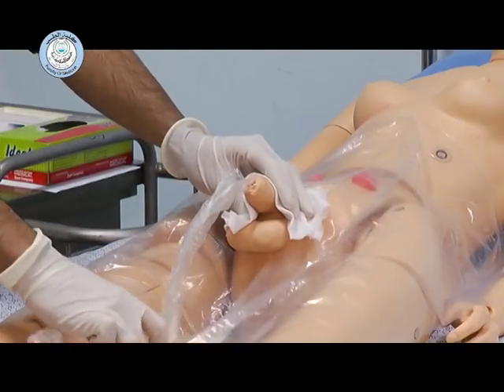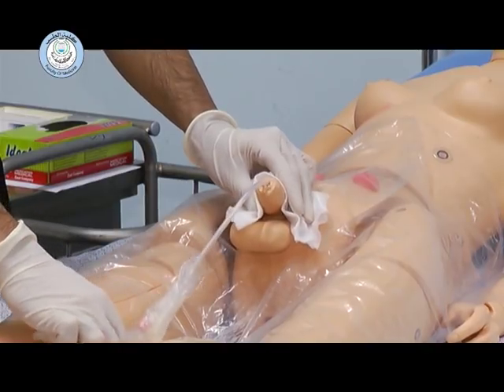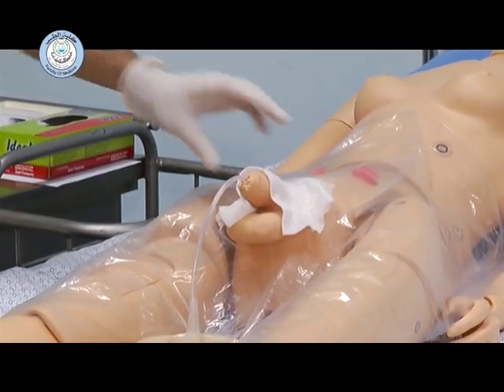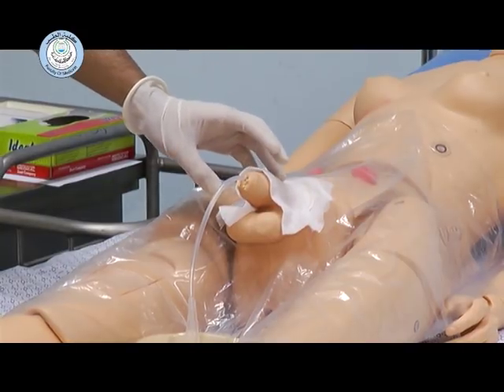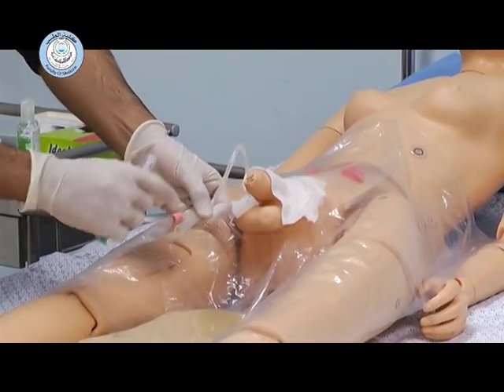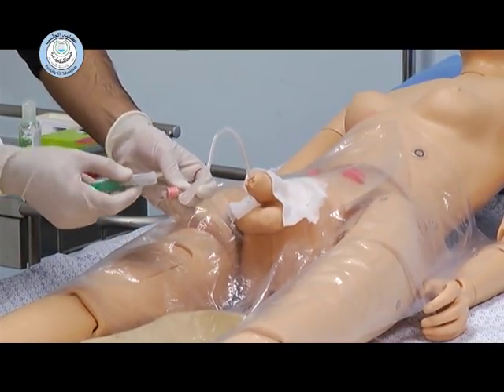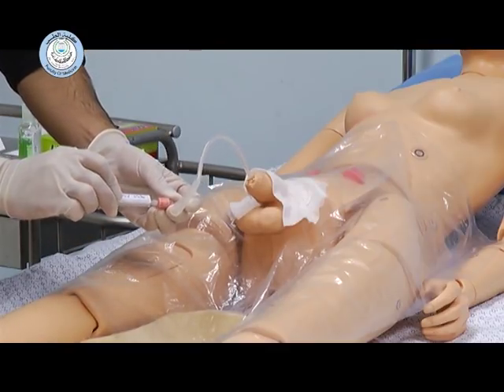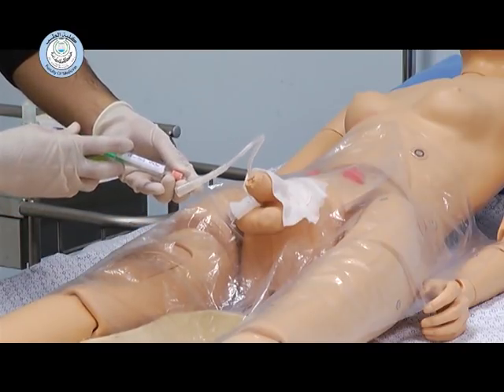Suppose that the urine starts to drain here. You can take the distilled water and read the capacity of the balloon — it is supposed to be 10 cc distilled water. Then after, keep eye contact with the patient and tell him to tell you if there is any discomfort.